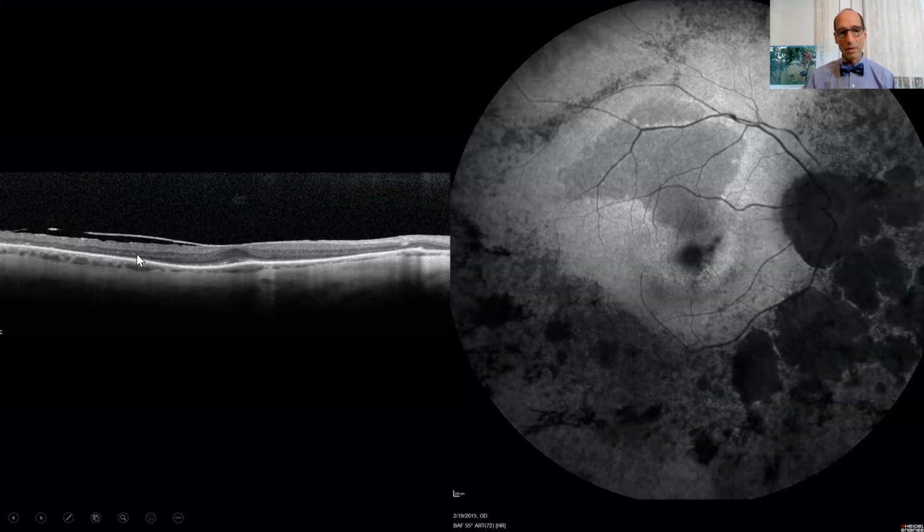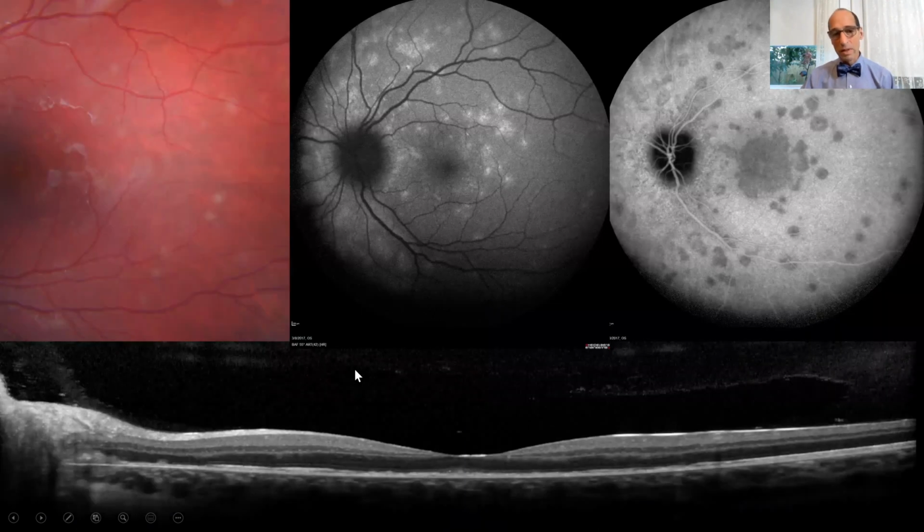Some diseases where you lose rods and cones, or this is a patient with a dystrophy. If you look at the OCT, you can see your outer nuclear cells kind of disappearing over here, and your photoreceptors definitely going. And then when you look at the autofluorescence, there's a bright area where the photoreceptors are not there or sick. And this is MEWDS. This is another photoreceptor disease. We'll definitely see this in conference. I haven't seen one lately. I think they're related to flu, and they come up in flu season, but that's another story.